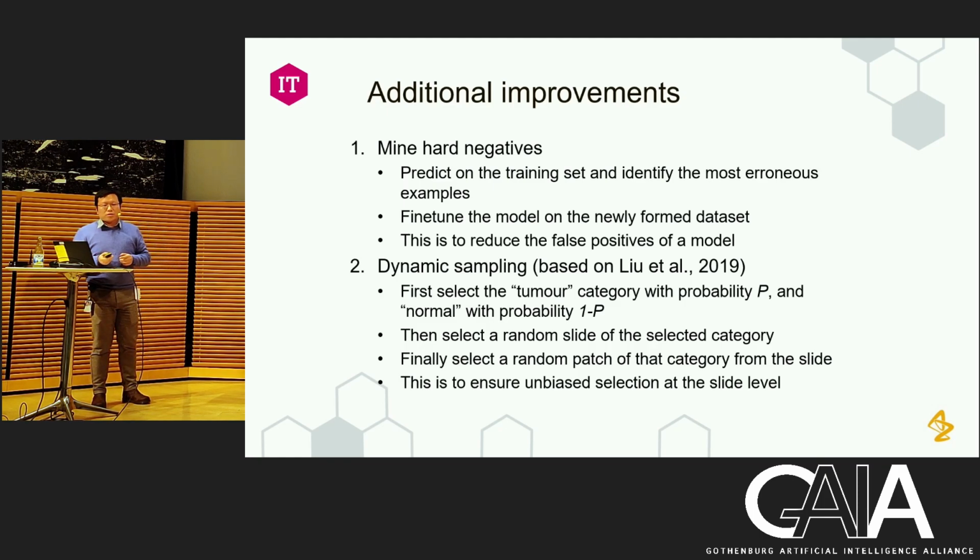The reason is to reduce the possibility of unbalanced selection at the slide level. This is done for each epoch.